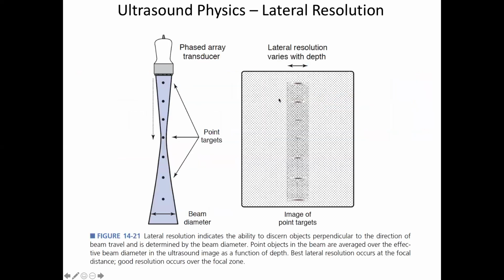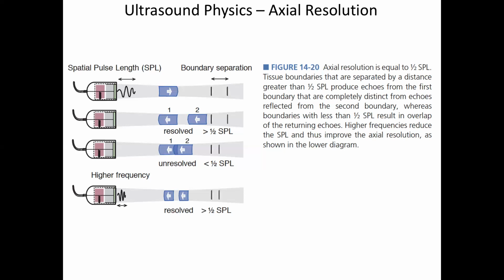Yeah, sure. Why wouldn't the frequencies be much higher? So as I understand, you have the maximum frequency, you would probably have a maximum spatial resolution. Right. So that is a very good question. Why don't you just crank it up? Because we can make ultrasound. This thing can vibrate at 20 or 30 megahertz.